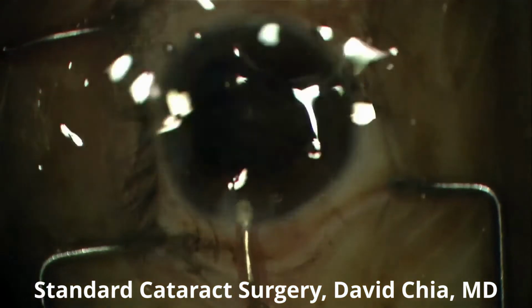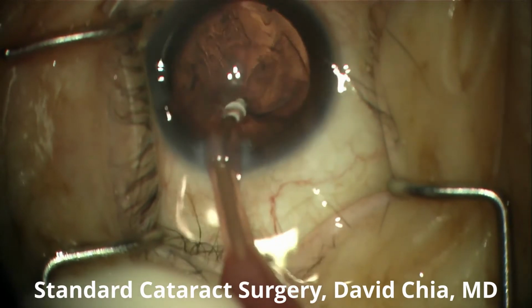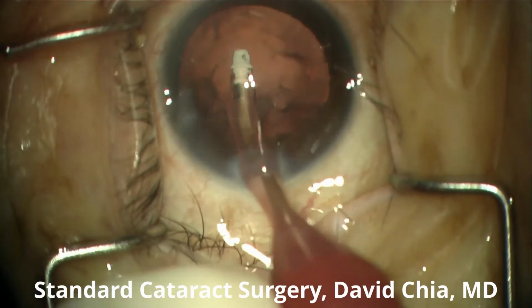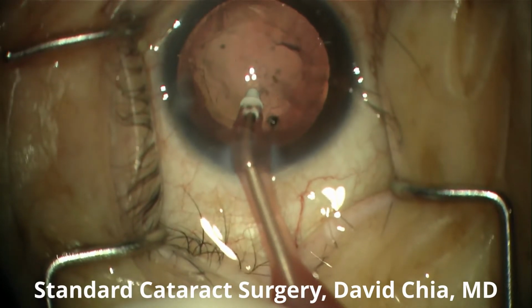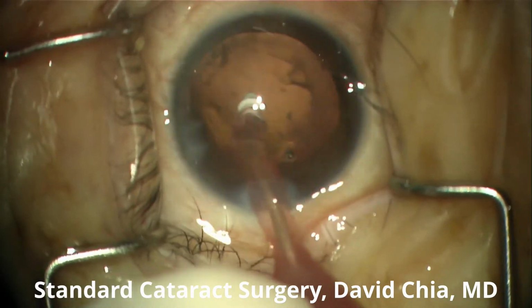And so here the irrigation aspiration handpiece looks quite different. It doesn't have the bare metal that we saw on the phacoemulsification handpiece. That little gray tip is the so-called polymer tip. This is very safe, very so-called capsule friendly, and it's very unlikely to rupture the capsular bag with this instrument.